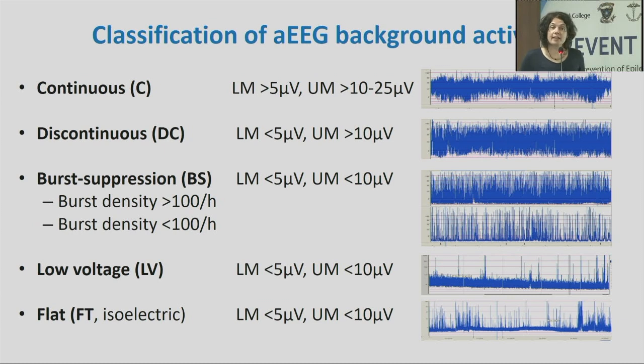This classification is the classification by Linda de Vries and Lena Wester-Sellström. There's a different definition which was used for the Toby trial, which is a bit more simplified and less. We are going to use this classification.